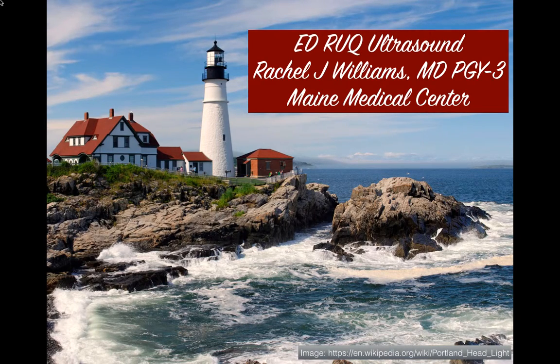Hello, this is Rachel Williams from Maine Medical Center, and today we will be talking about the bedside focused right upper quadrant ultrasound performed by the ED physician.